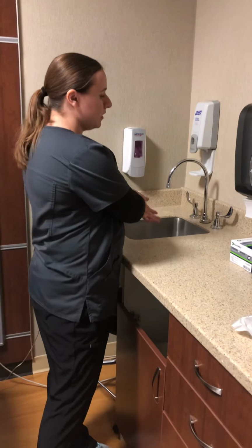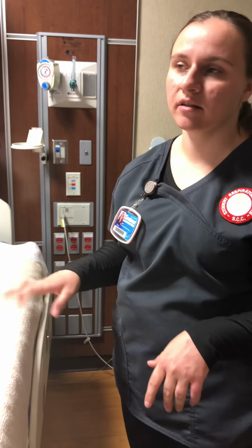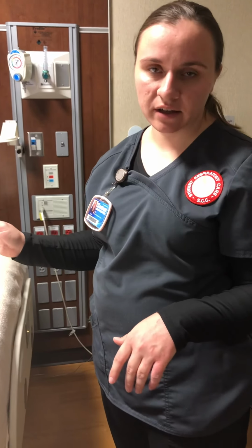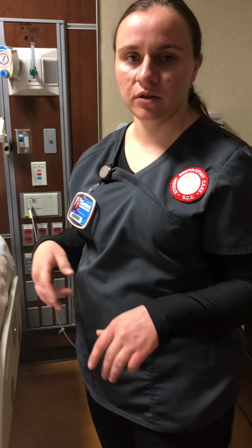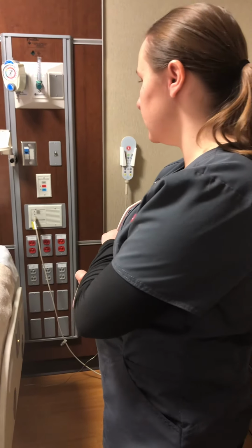So I'm going to come into the patient's room, introduce myself, always knock on the door, and then I'm going to check the patient's ID band, and then I'll wash my hands, dry them, and then I'll auscultate the patient's lungs and get down the vital signs, anything that I may need to, that way I can place that in the charts before I do the procedure.